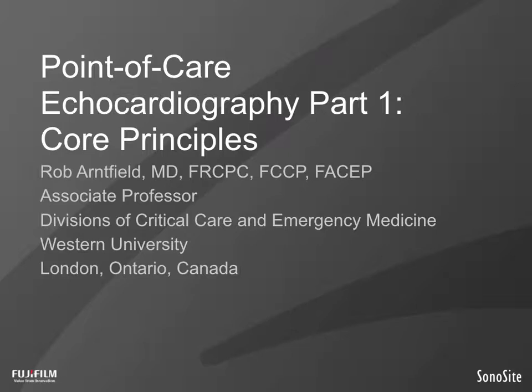In this initial episode, we will focus on the core content that all resuscitative experts must know in order to look after critically ill patients.